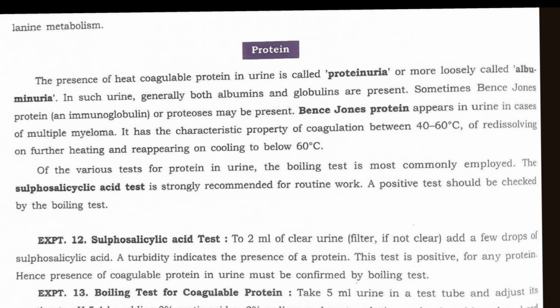Sulfosalicylic acid test, experiment number 12. To 2 ml of clear urine, filter if not clear. 2 ml क्लियर यूरिन लेना है, अगर क्लियर नहीं है तो फिल्टर कर लेना है. Add a few drops of sulfosalicylic acid, कुछ बूंदें सल्फोसैलिसिलिक एसिड का ऐड करना है.